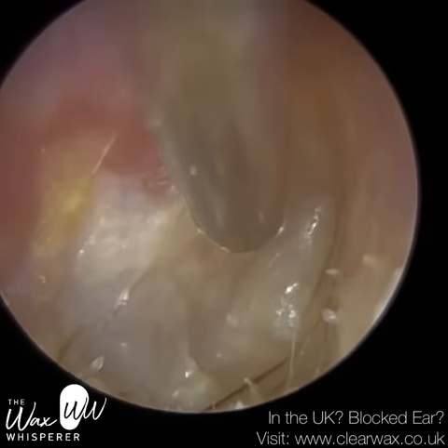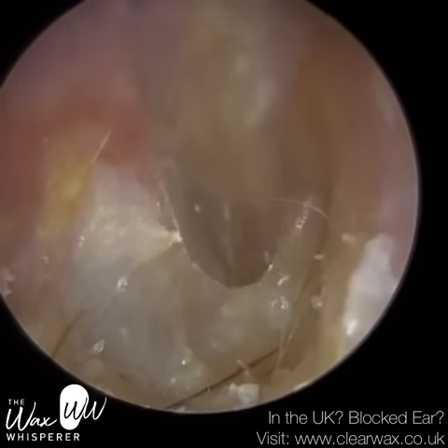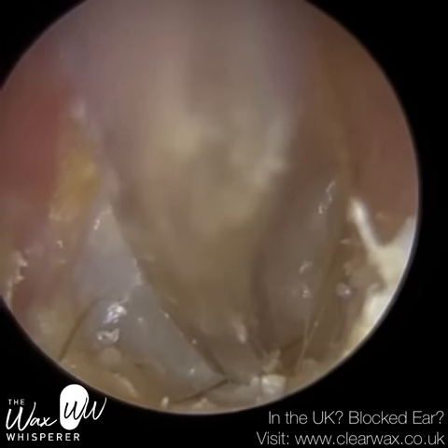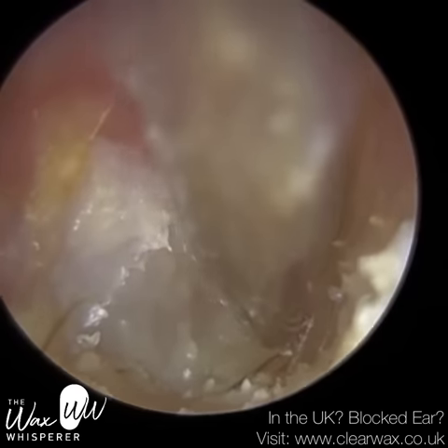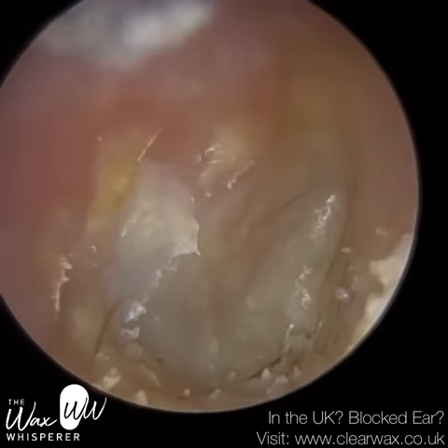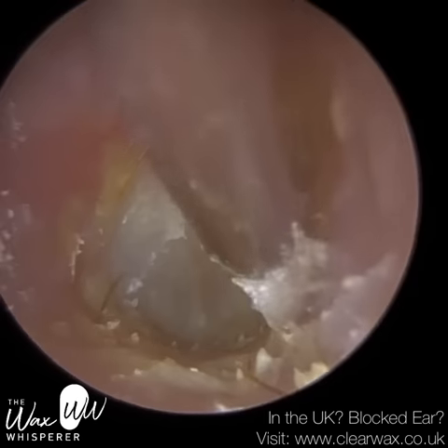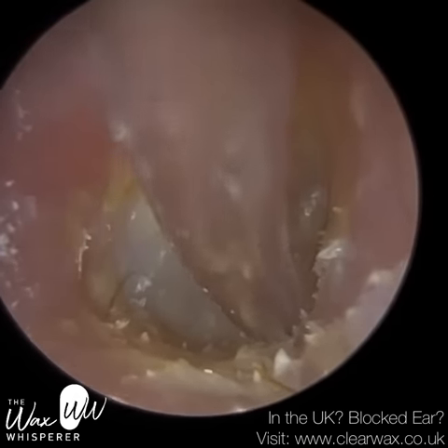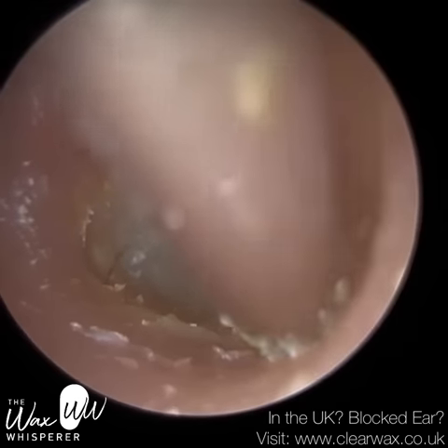The patient's daughter who attended was fascinated. The way my clinic room is set up, if I'm performing the procedure in the patient's right ear, their significant other — a friend, loved one, or family member — can actually watch because they're looking over my shoulder. In the left ear, given the room setup, it's somewhat more difficult. But the patient's daughter wanted to watch the left side, so they came around. A lot of patients and family members enjoy watching. I've always toyed with possibly putting it on a big screen, but I've decided against it because patients might get anxious watching the approach to the eardrum on screen and make sudden head movements — a patient safety concern. So we show the videos back to the patients afterwards instead.